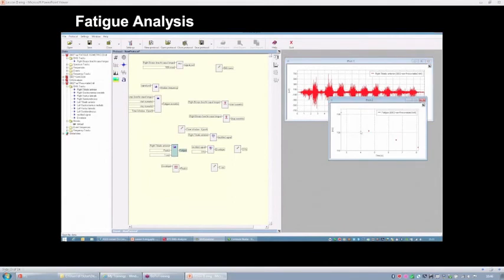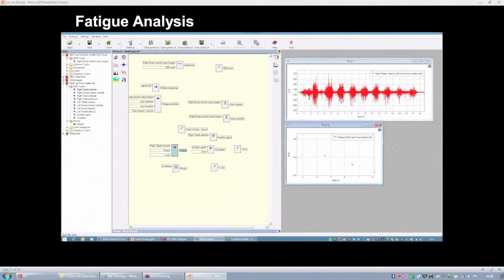As you can see, also in this case we can see a decrease of the median frequency during the different contractions of the muscle. So this is another example of how to use the frequency analysis of an EMG signal to investigate muscle fatigue.